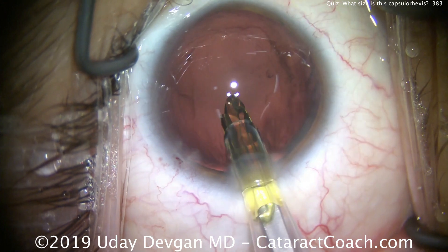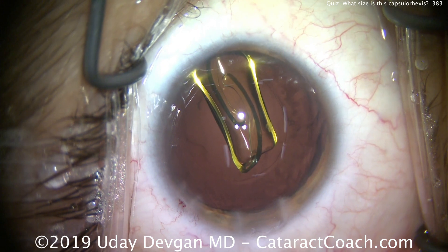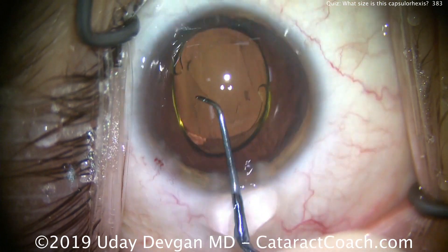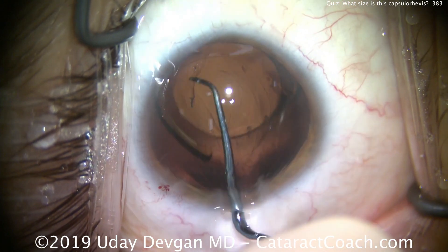Here's a little bit of a surprise: this is a full-size IOL with a 6 millimeter optic, but look how small the lens looks. This patient has a very large white-to-white measurement of about 13 millimeters.